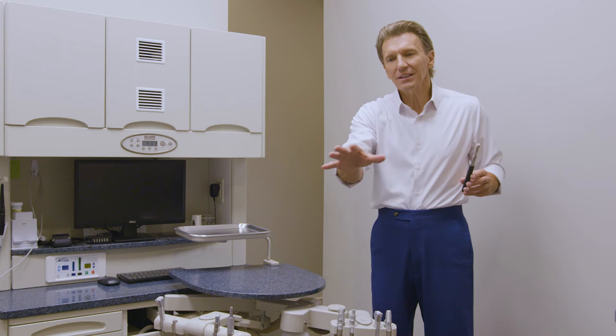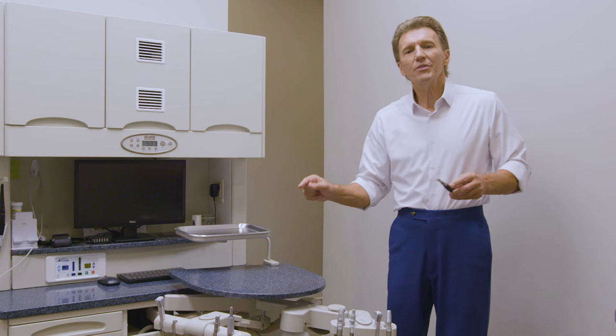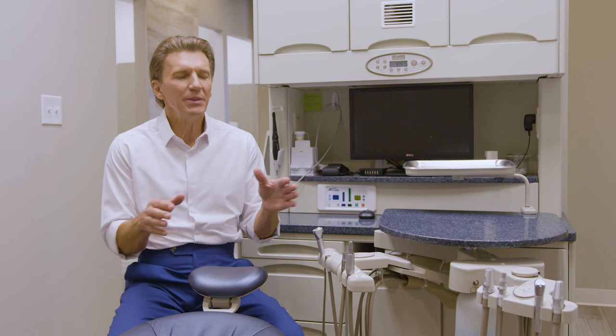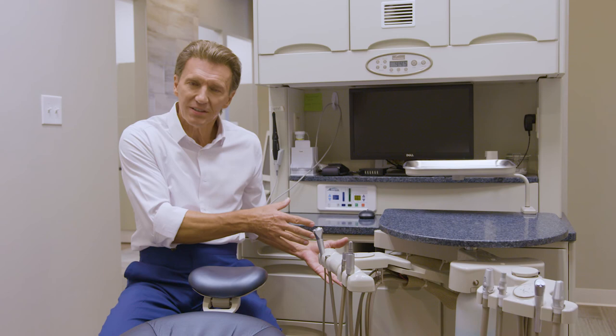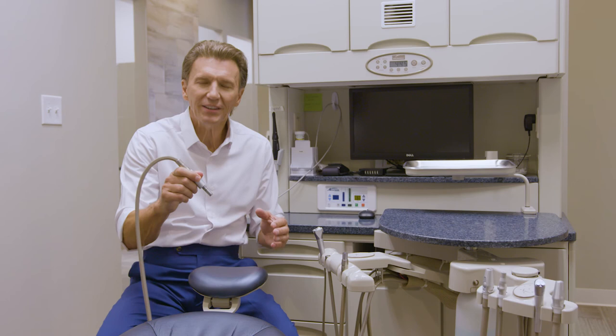Now that I'm in the seated treatment delivery position, it becomes more obvious what the ergonomic challenges are of flexible dual-function rear delivery. Instead of having the doctor's module directly in front of me like with split delivery, I now have it to the side of me. To retrieve my hand pieces, I have to loop the tubing back around to get to the oral cavity. Once in the oral cavity, I have good ergonomic access, but as soon as I return the hand piece to the holder on the doctor's module, it's an awkward transition.